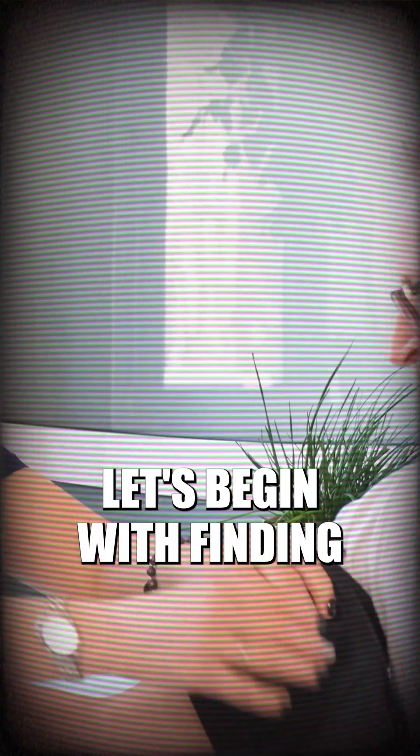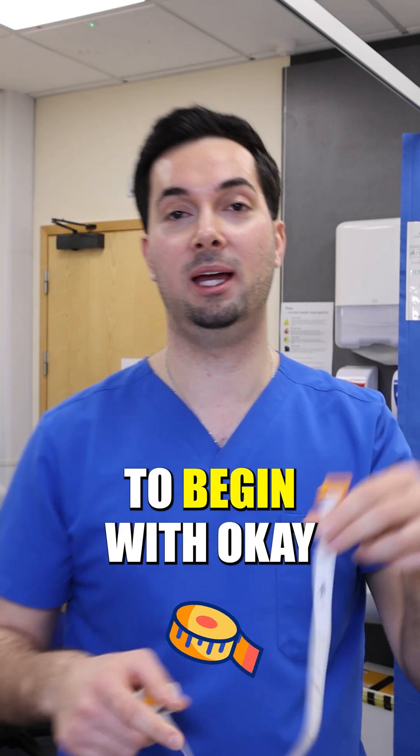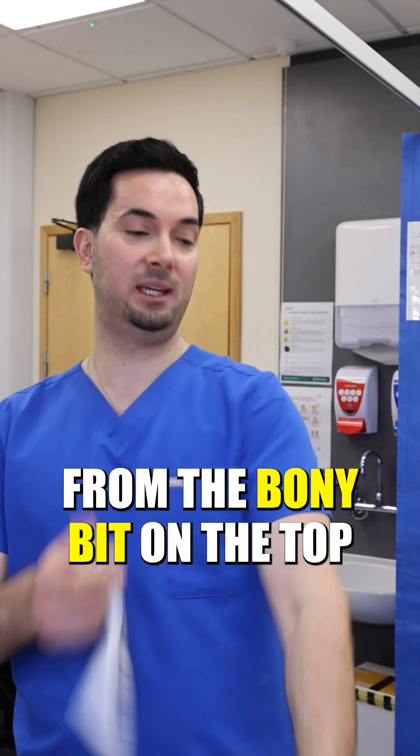Okay, so step number one: let's begin with finding your correct cuff size. You're going to need a measuring tape to begin with.